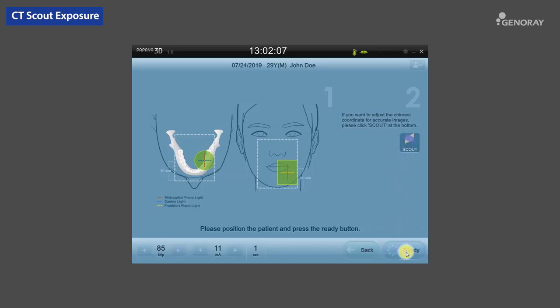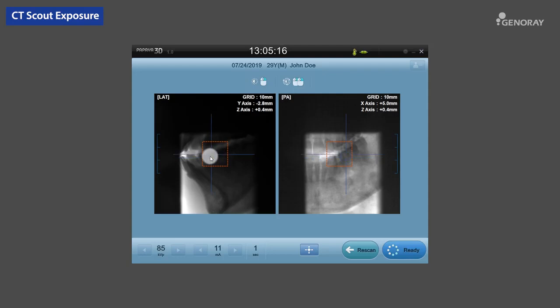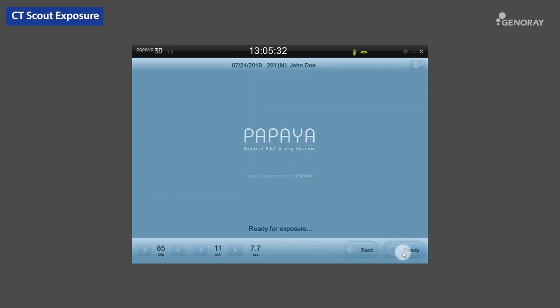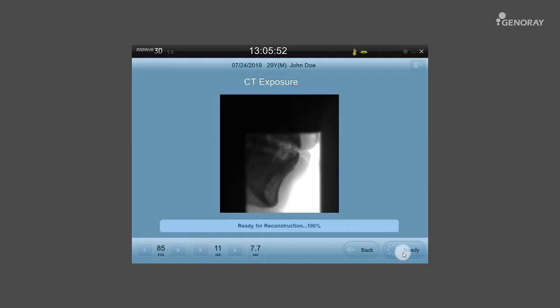Before starting scanning, if you want to scan an accurate area of the teeth arch, click the Scout Exposure button. Once the patient is properly set, select the Ready button on the OP and follow the instructions on how to hold the hand switch down until the exposure is completed.